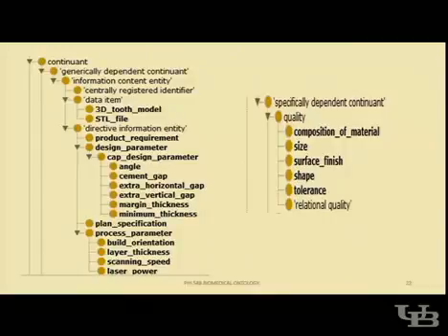So how do you make your terms more specific so that angle doesn't get confused with the general term of angle, even if you mean it in a specific context? Actually, I should include the pictures of the cap that have the label with the angle and so on. There is a terminology that you use there. But I think when people in general use the term angle, they don't mean a cap design parameter. Yeah, I agree with that. Thank you.